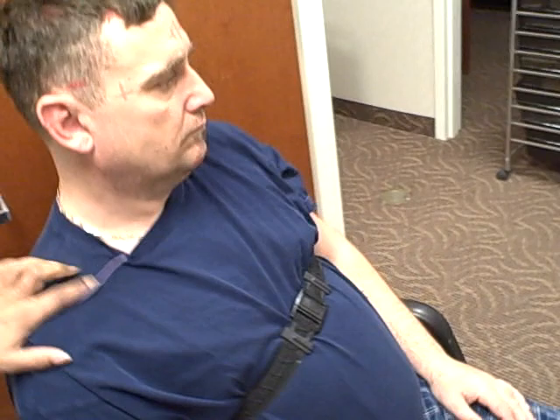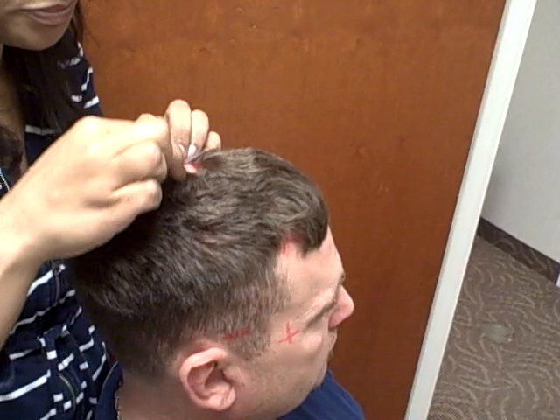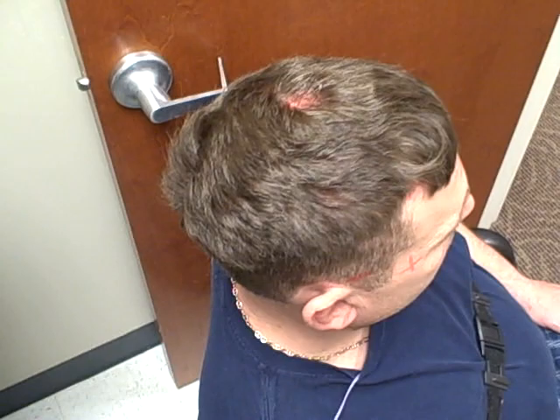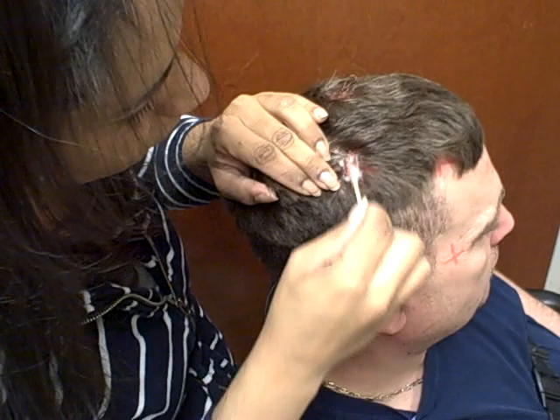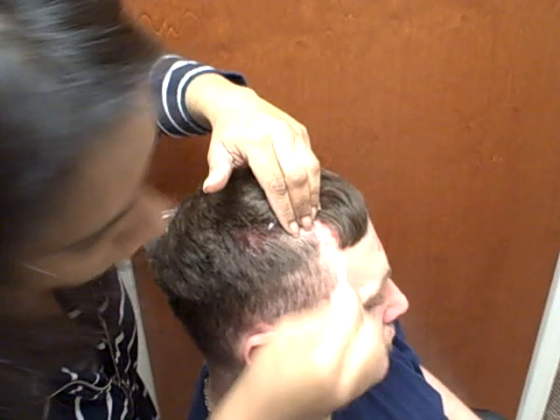Now we're going to commence with cleaning and prepping the head. You're going to come in with a Q-tip and clean with alcohol first, then clean the same section with NuPrep. I find it easiest to just go through and clean all the areas that you need to have prepped first, basically going through and cleaning all the marked areas of the head.